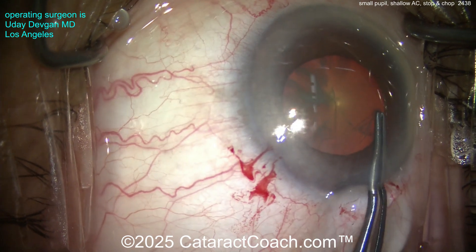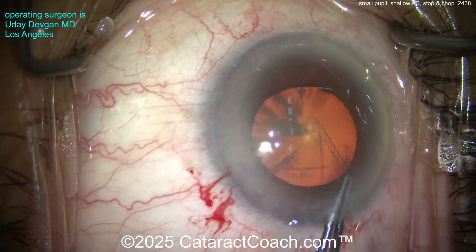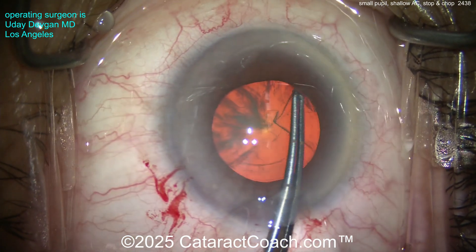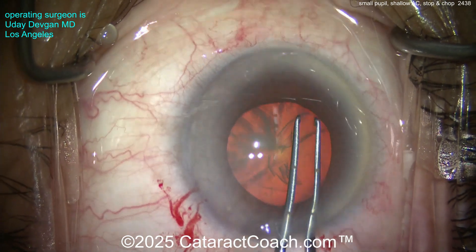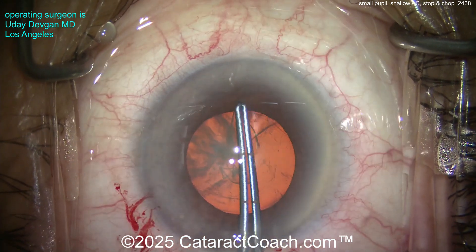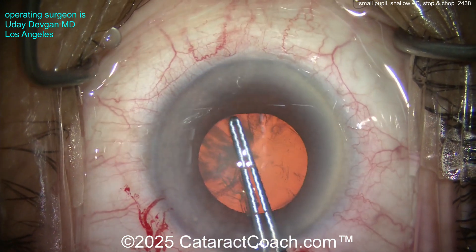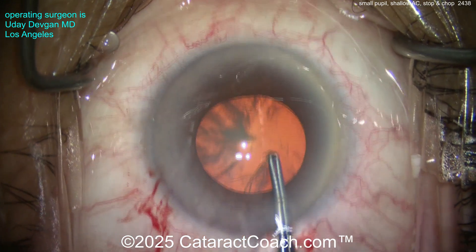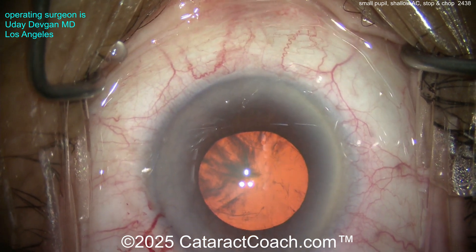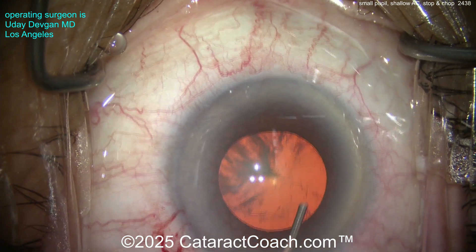We're going to make a nice rhexis. I've got a little bit of viscomydriasis — this is a trick Bobby Osher taught me — you can use the visco to temporarily increase the pupil size. Even then, I want to make sure I get a nice generous rhexis, still a five and a half millimeter capsulorrhexis. Our forceps are marked at two and a half and five millimeters from the tip so I can measure it — that's about five to five and a half millimeters.